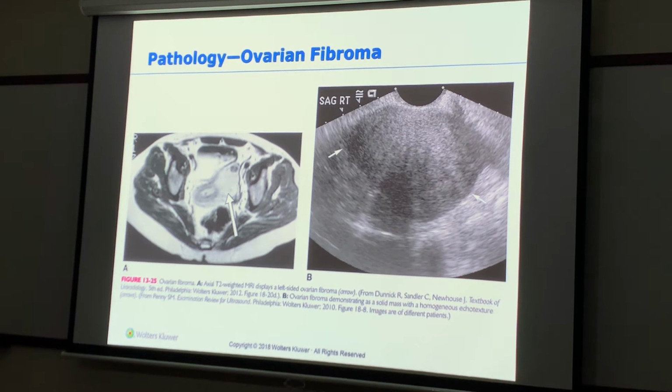1, 2, 8. 3, 4. I always do a mid again, so the doctor doesn't get confused. It only takes a minute. So 8. Not even a minute, 5 seconds. So anytime I look at something, if I'm mid and I go left, I go back to mid and take another image. I'm letting the doctor know, okay, I'm back at mid, now I'm gonna go lateral.